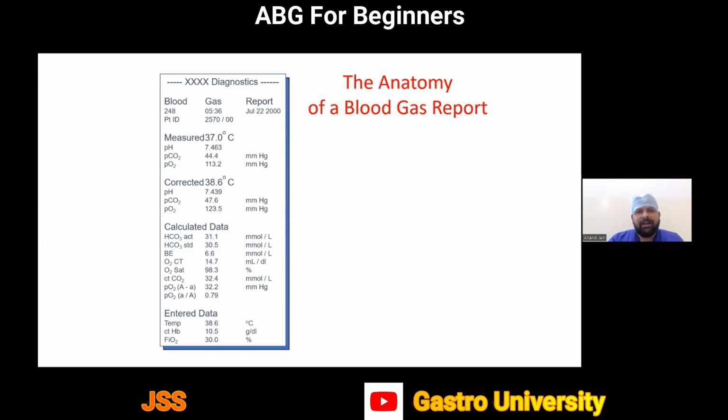This is a simple picture depicting how an ABG looks. As you can see over here, there are various things mentioned, for example, at what time the ABG analysis was done, what is the ID of the patient, and when the report was generated. Then come our various values, like pH, PCO2 and PO2, which are actually measured by the arterial blood gas analysis machine.